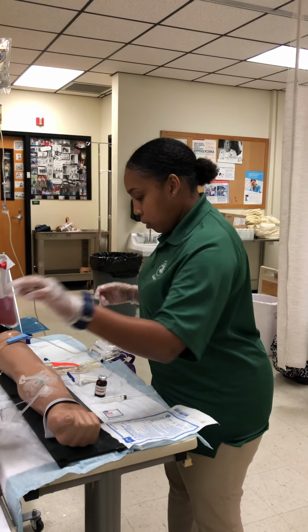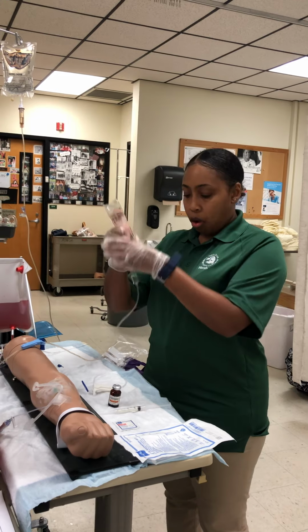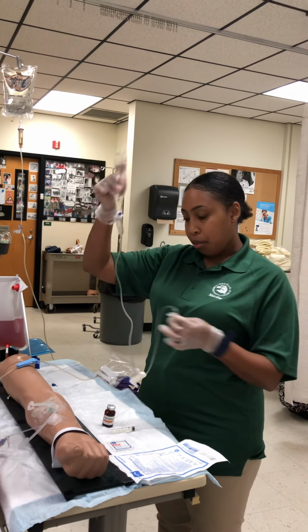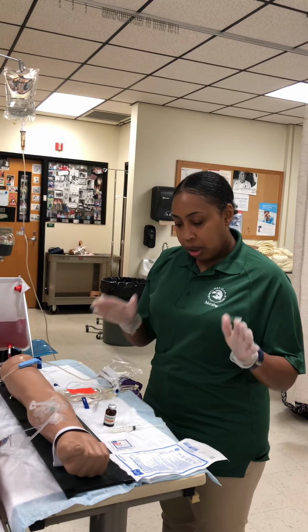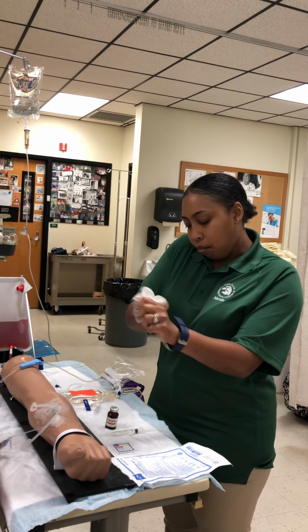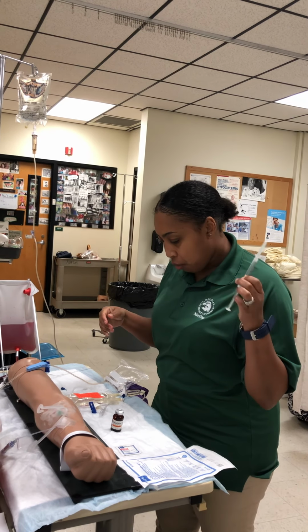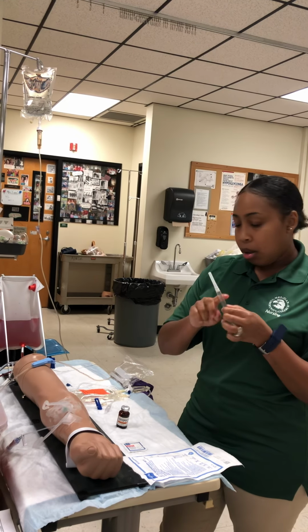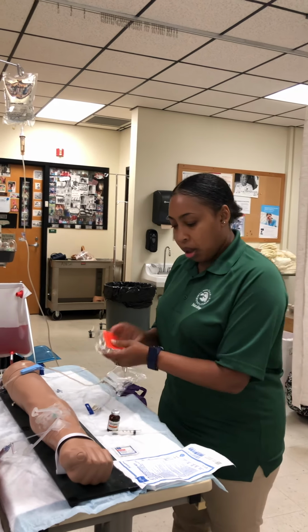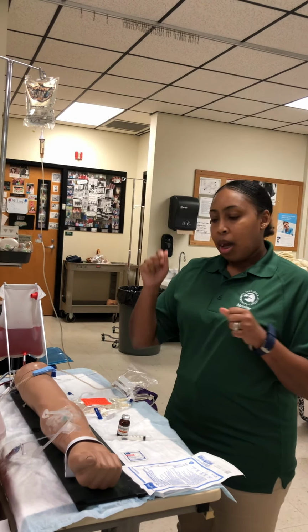At this time, we could have primed our tubing in the room, or we could prime our tubing at the bedside, but because this is my second time, my tubing is already primed. We're going to gather all our equipment, gloves, alcohol, our furosemide. We're going to make sure we put a label on our syringe also, with furosemide on it, 3 milliliters on here. And like I stated, this is already labeled. Now we're going to proceed to our patient's room. Knock, knock.